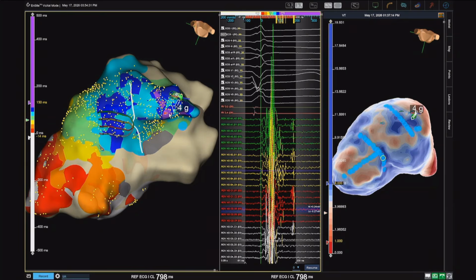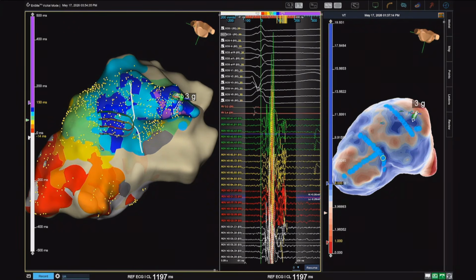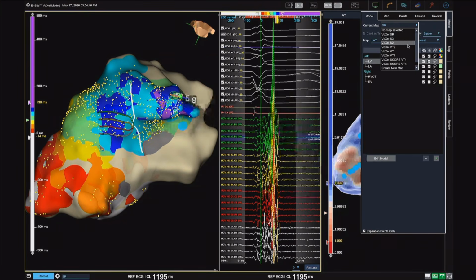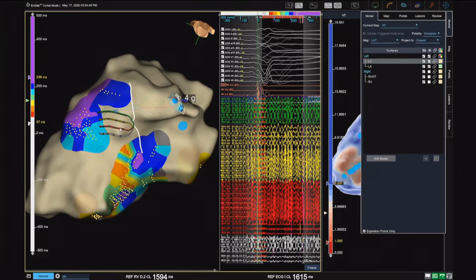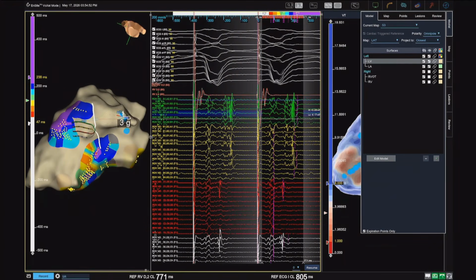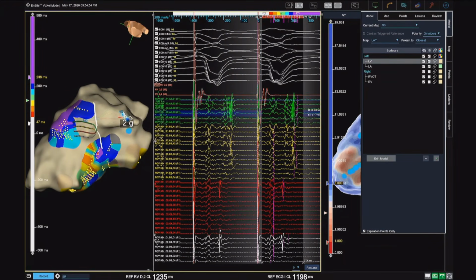So then there is a second region, less basal. Show the other region, less basal, Maria. Okay. So these are not as late. At the beginning, we thought they were late. And during S3, can you show the S3 here, please, Maria? Because I think we had beautiful S3 potentials here, close by. Like this one.